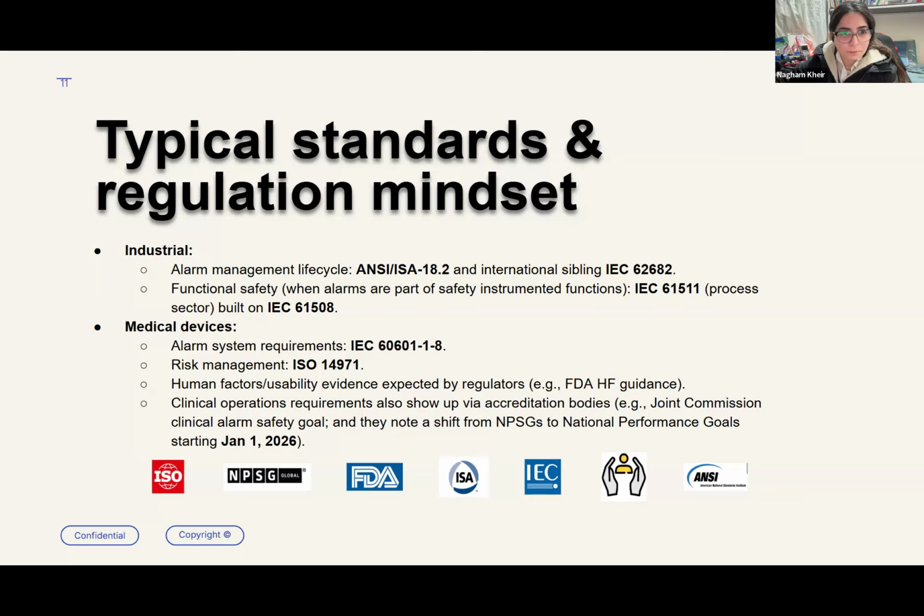Only if you'd like to, but let me go over the regulators, like guided by the FDA human factors guidance and the IEC 62366-1 ecosystems. The expectation is to prove that the user interface, including alarm interaction, minimizes use-related risks and that intended users can operate the system safely and effectively. The rotary encoder used, for example, in Krake. I'm going to try to stick to just mentioning the standards, and then I'll jump into Krake and ADaM, as I mentioned before.